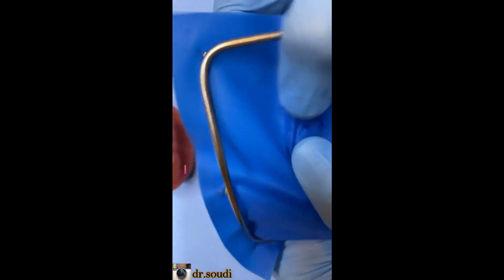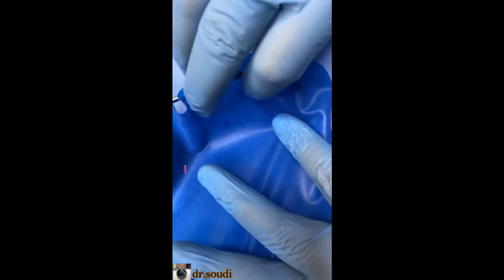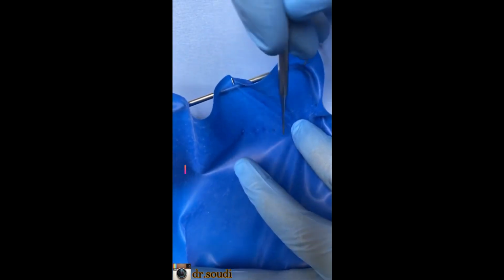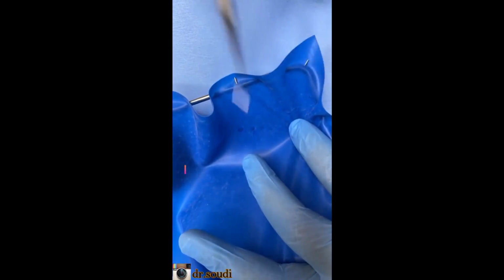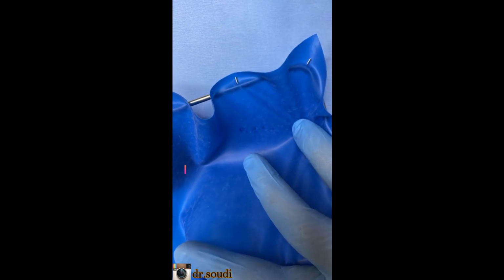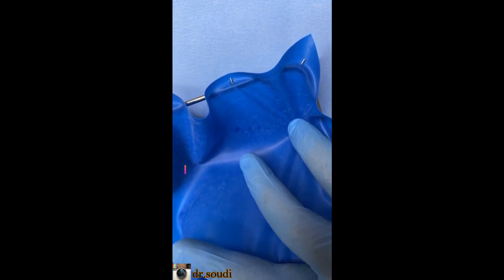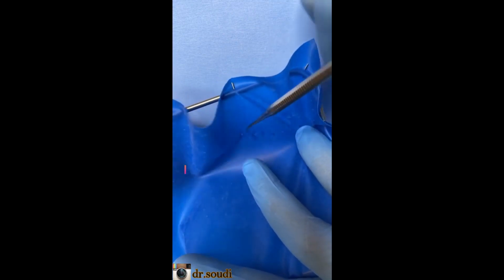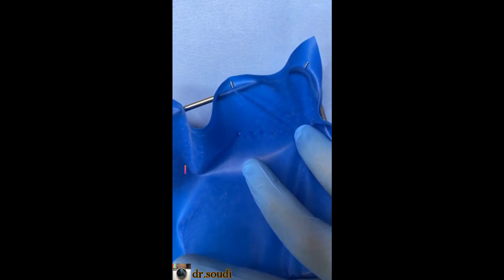There is another trick to make this sheet pass easily through the contact. You can use lubricant on the inner surface. Lubricant, maybe soap or Vaseline. Okay, small increment, especially if you are doing restoration. I don't recommend it in cementation because Vaseline may get through your holes and make it difficult.